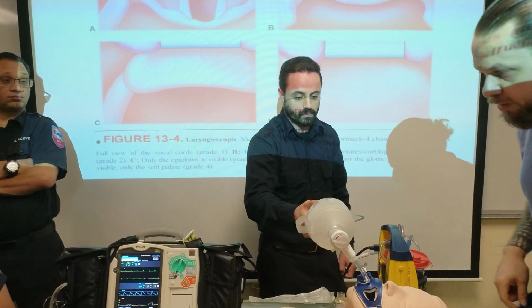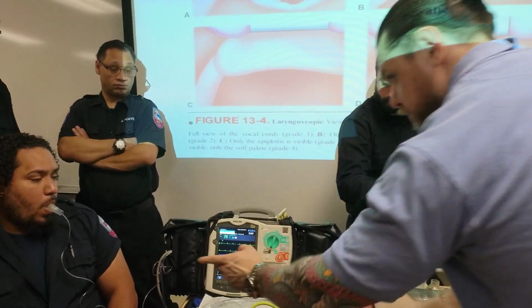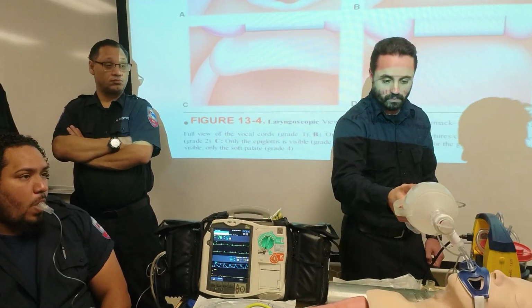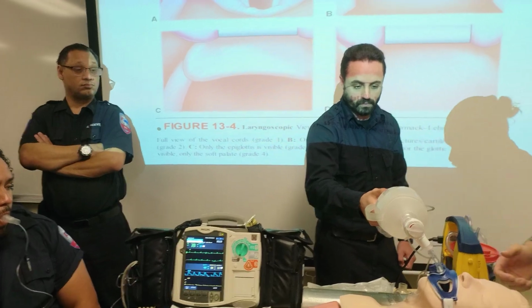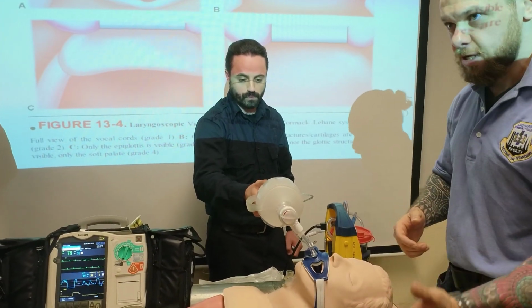This is what I do. I come in. I don't know if I have paper here. Let's see. I don't have paper. So what I will do is I'll print the strip out at the time frame. You see how it marks? I will come over to the bedside and say, who's the attending? Who's going to be taking care of this guy? Or they say, this is Dr. Smith. Dr. Smith, can you come over here?